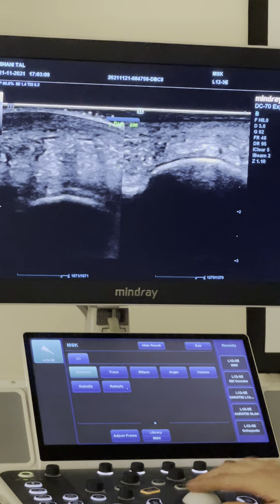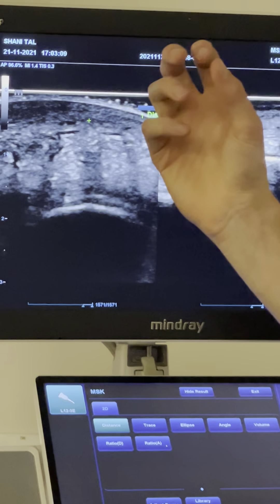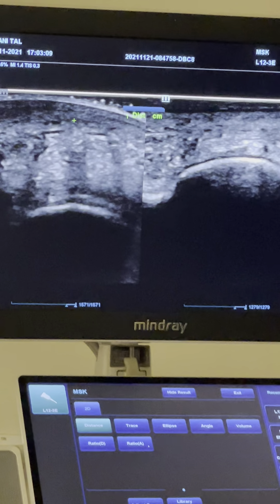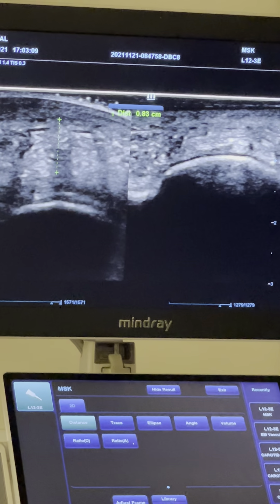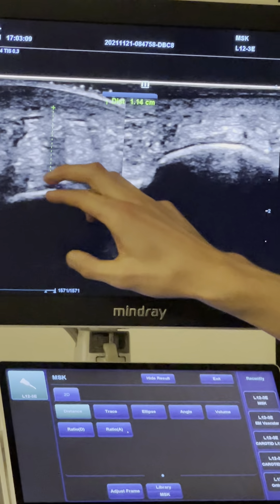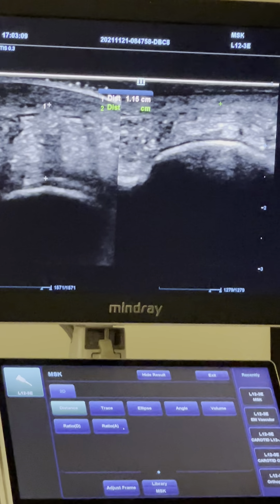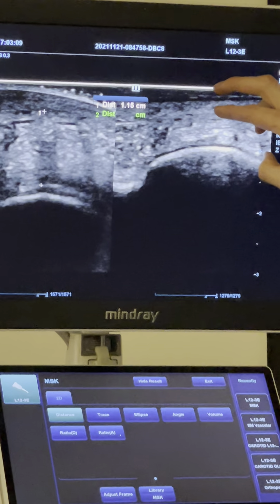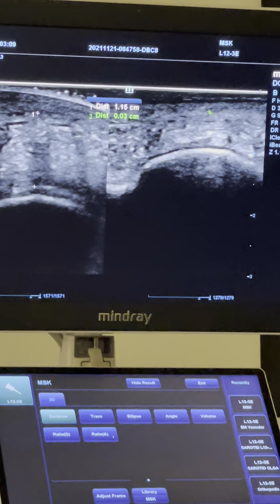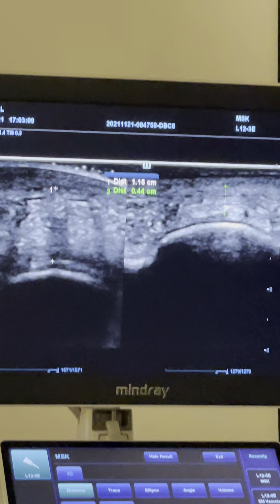I will use the measurement tool and measure from here because this is all the skin layers — it's really thick underneath the heel. So we start from the hyperechoic region and scan until here, because this little layer is the plantar fascia. So it's 1.14. And here we do the same: from where it becomes hyperechoic, because the lines above are the skin layers, and put the marker also above the plantar fascia.